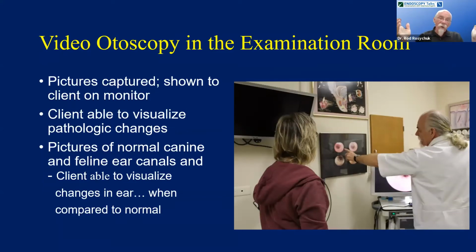As far as how I use my video otoscope, first of all, I virtually use my video otoscope for the examination of every patient that comes in to our service. Of course, we do work in a specialty dermatology and otology service. All of our dermatologic cases receive an otoscopic examination, which I think is best medicine, because of the high incidence of association of skin disease and ear disease, allergic problems, for instance, very commonly being associated with otitis externa. So everybody gets a video otoscopic examination.